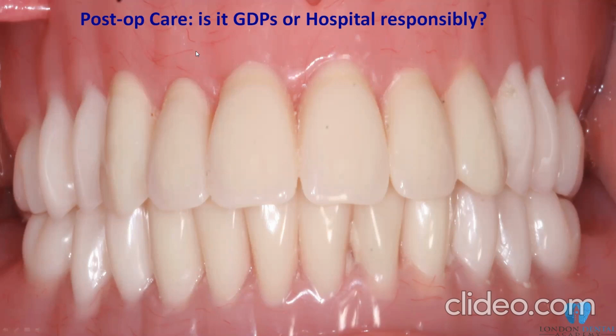Look at the gums, as you can see, very nice, very subtle vascularization of the pink acrylic, mimicking the gums as much as we can. Sometimes you can even change the shade due to the racial pigmentation. You can have some darker or lighter. I've got 5 shades in my lab, so I can change whatever I want.